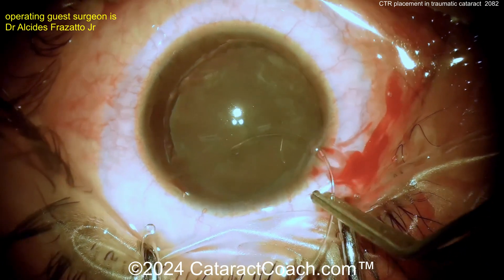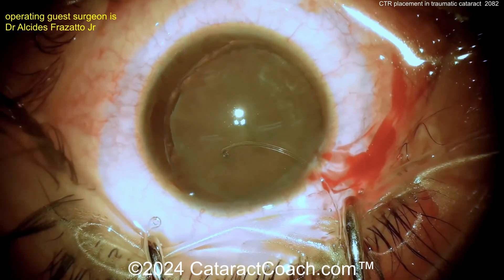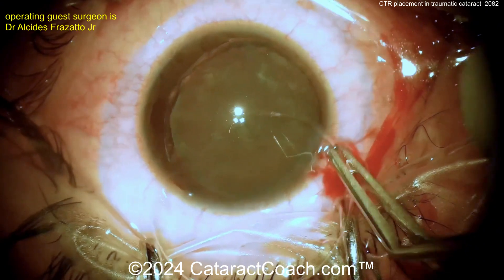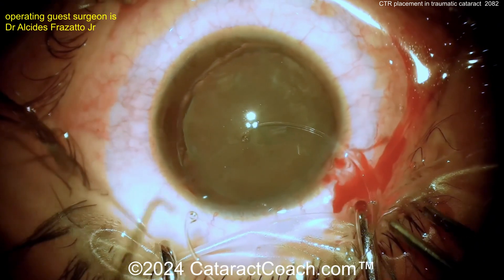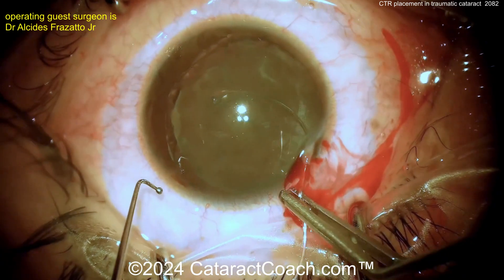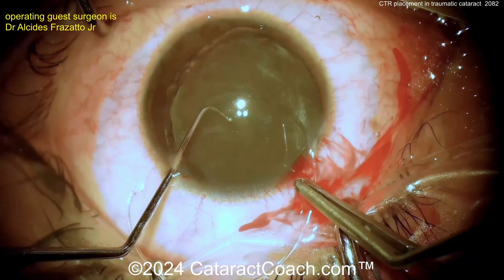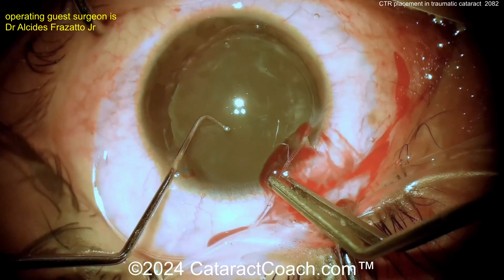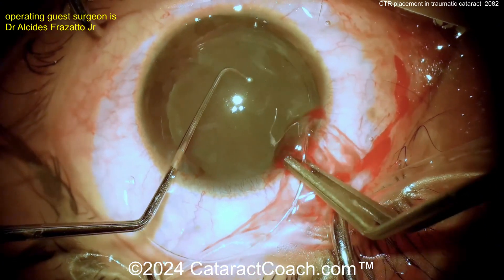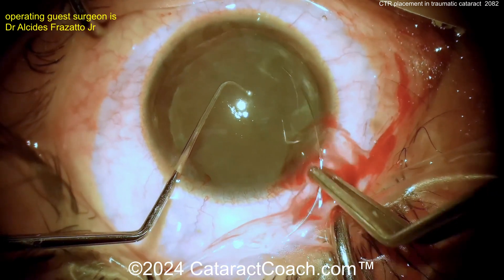CTR going in. Maybe that was viscoelastic to expand the area under the anterior capsule rim — maybe a little dispersive viscoelastic. Here comes the CTR being placed manually. You need to make sure it gets under that rhexis — that's obviously key. I like the chopper there to push it down a little bit or guide it. You've got to get under that, and you want to do this circumferential motion. It's going around pretty nicely.